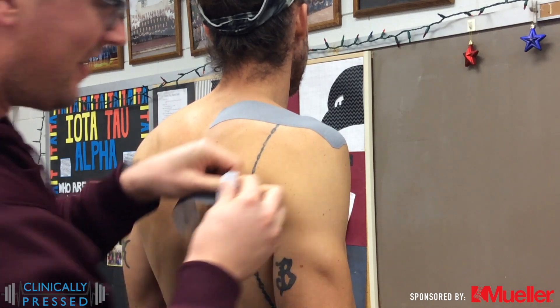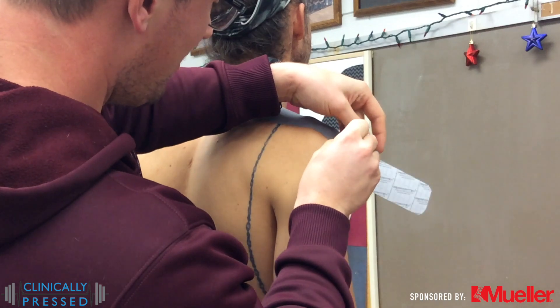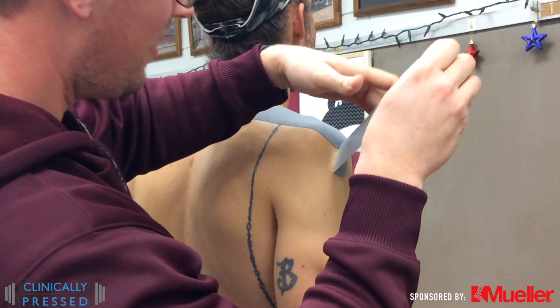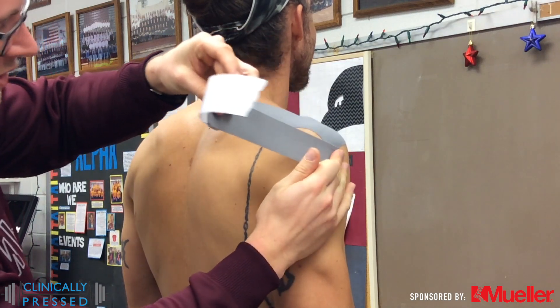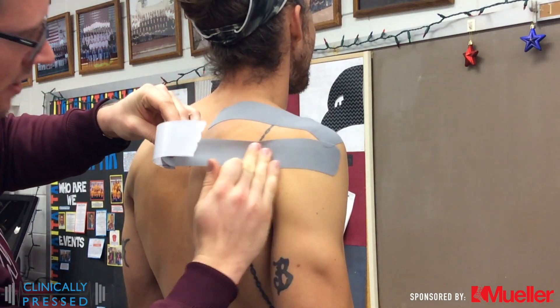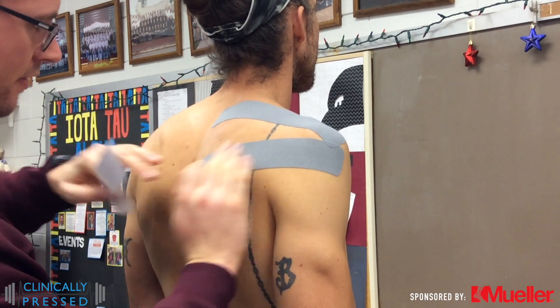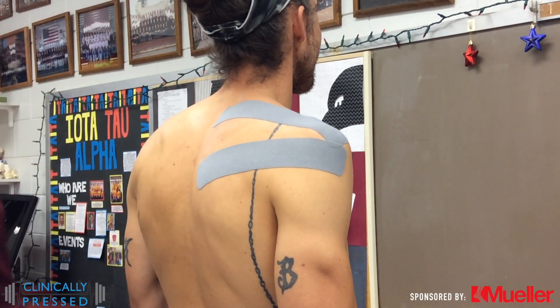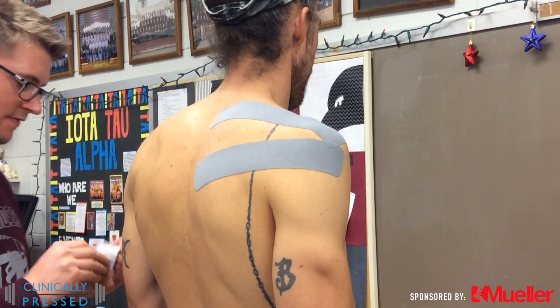For this one we're doing more of an infraspinatus, so we're getting all the way to the lateral side of the deltoid, as that muscle works as an external rotator. Lay it on our anchor, peel back our backing, pull that tension on, and pull it across. We actually want the anchor a little far as we're laying down on top, just off of the medial border of the scapula.